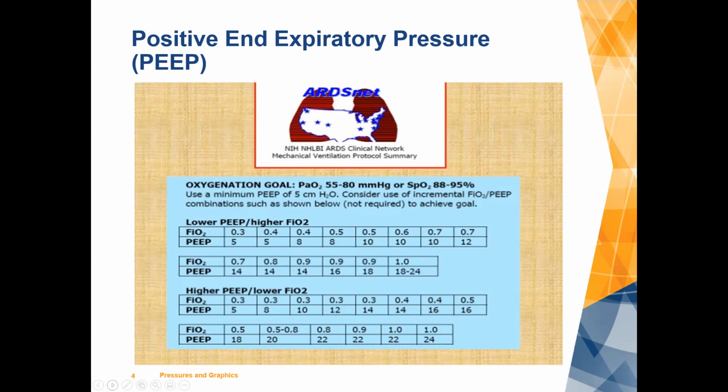So one of the things that I'm kind of a stickler with in the ICU is, the intensivists are sick and tired of hearing it, but they've come a little bit in my direction. And that is that we probably underutilize PEEP, and we set it in an arbitrary manner. We used to set patients when they came up from the OR, or came from the ER, trauma patients, or the recovery room, et cetera, we put them on 5. Now our starting point for most of those patients is 8.